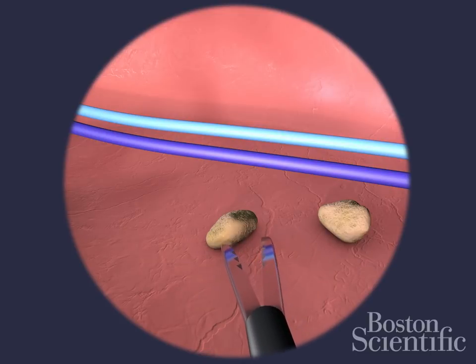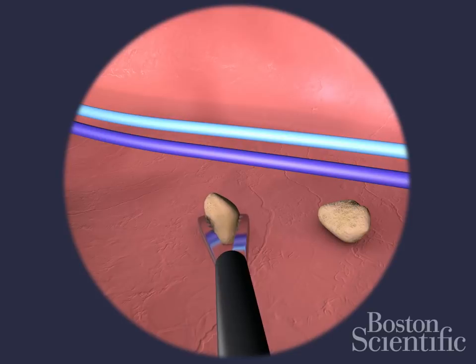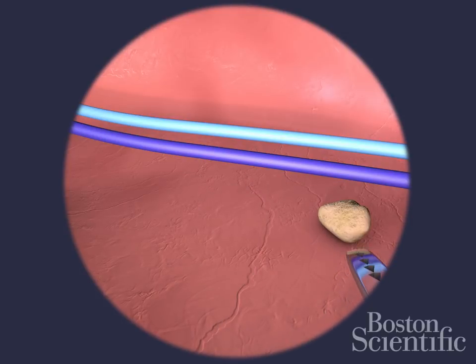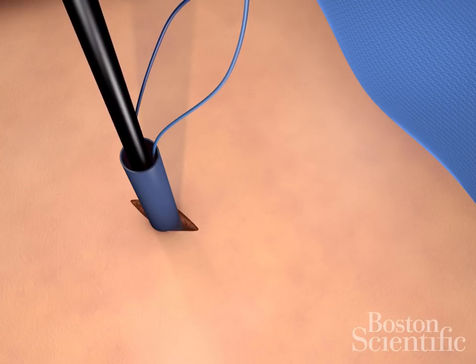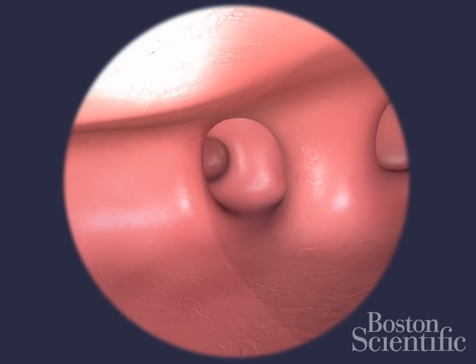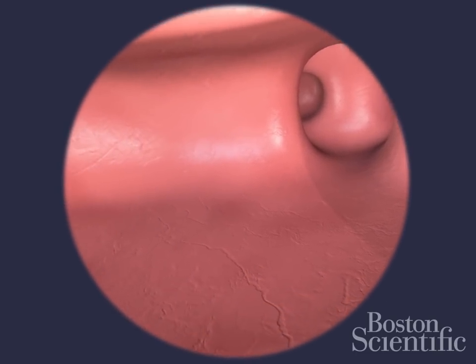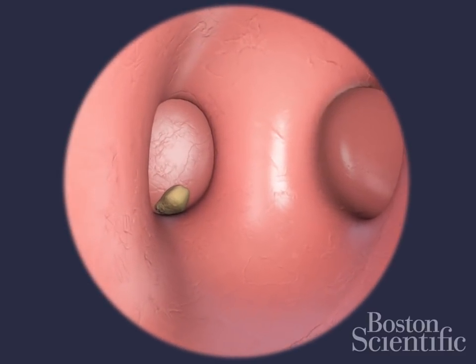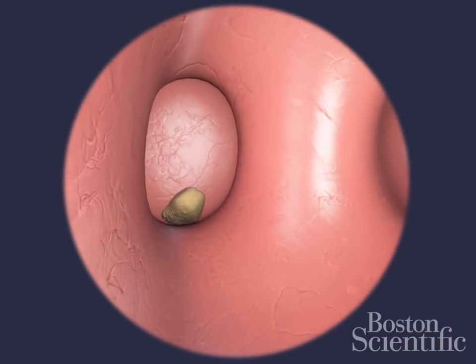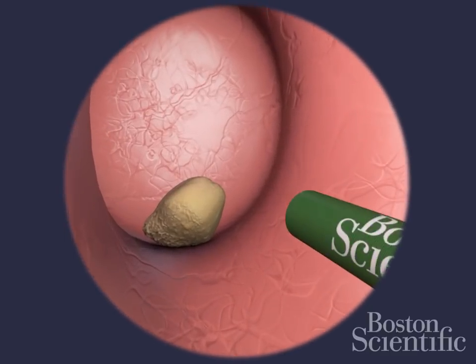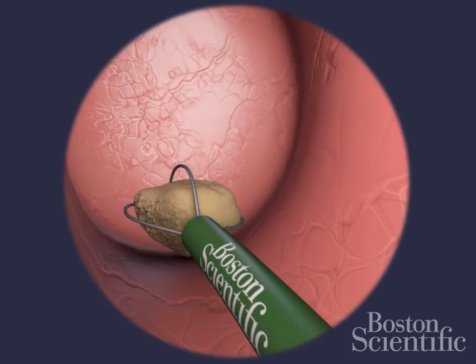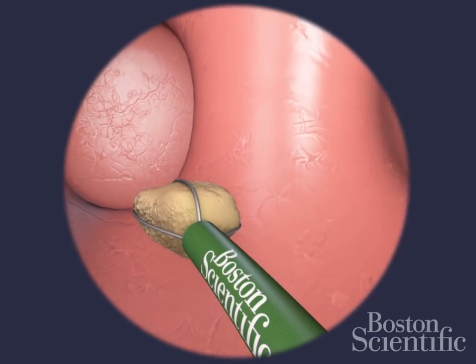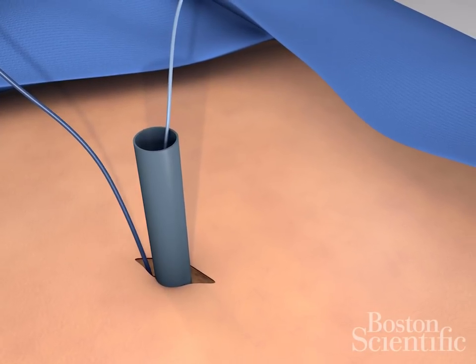Insert rigid graspers through the nephroscope to collect stones. Remove the stones and the scope. Insert the flexible cystoscope. Look for remaining stones in the calyces. Insert the basket into the scope to capture the stone. Remove the stone and cystoscope.